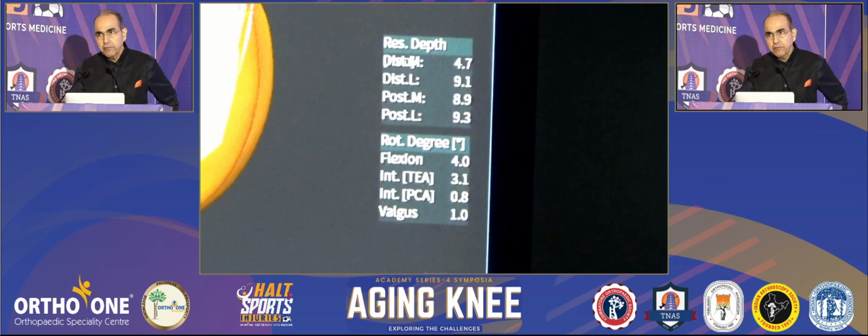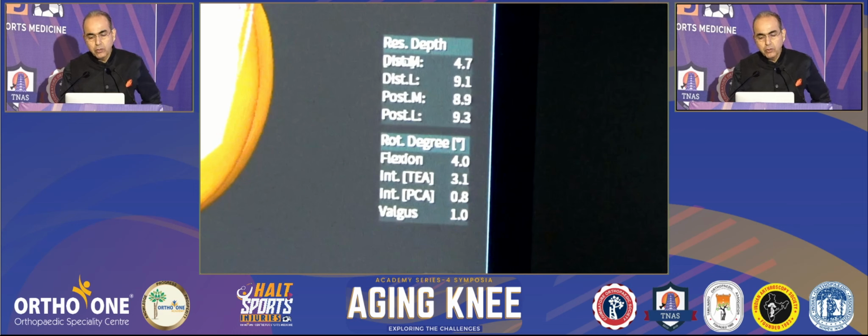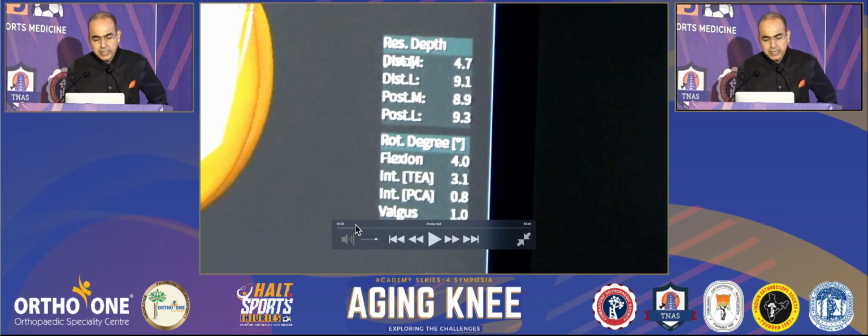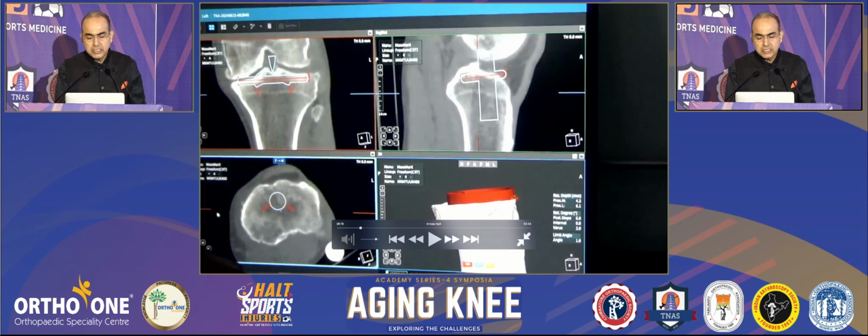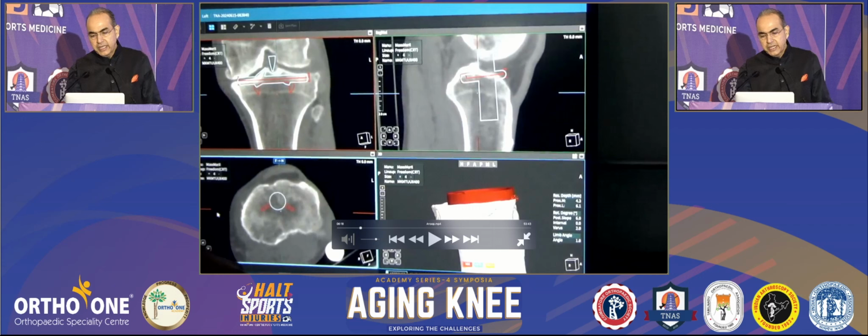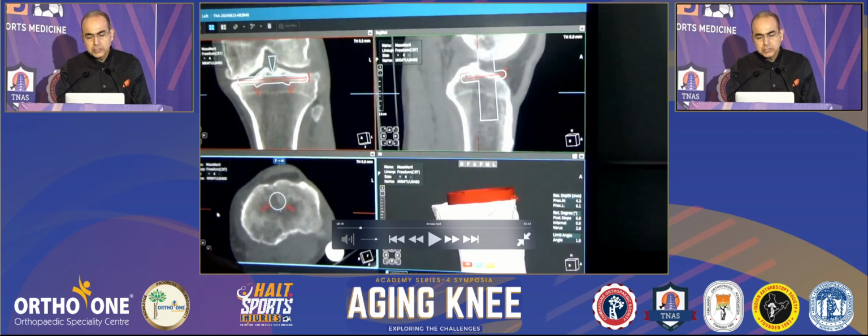And the flexion of the femoral component, we often don't talk about it, but it's very crucial to keep it between 3 and 5 degrees. Once we have planned our femur with a size E, we can plan our tibia. You can see that the tibia is in varus 2 degrees as a starting point. We can increase if required, but in this particular case, we thought that 2 is pretty okay.